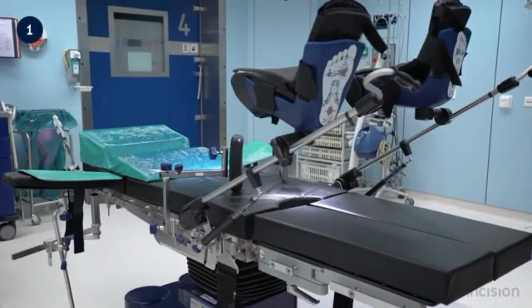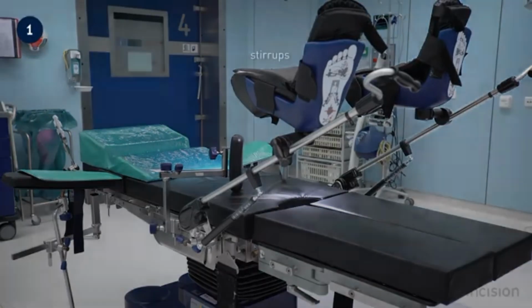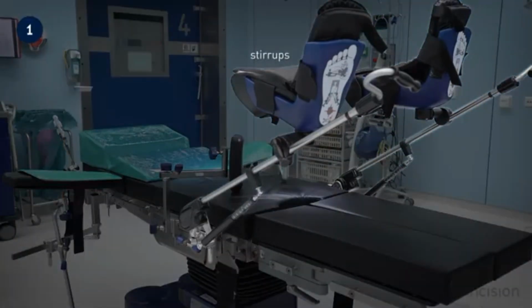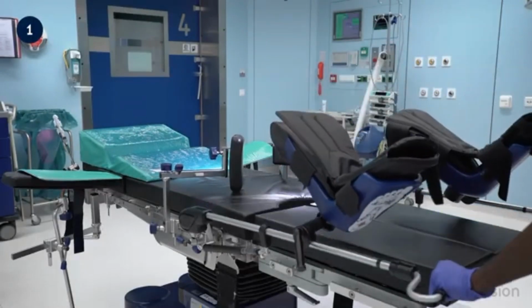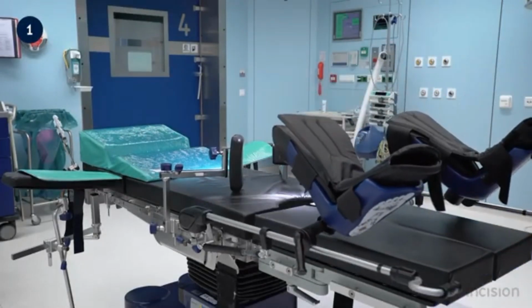The patient's legs can be positioned in a variety of ways. Stirrups are used when the patient is placed in the lithotomy position. This particular set of stirrups can be adjusted to allow different degrees of flexion of the hip. These are but a few examples of accessories that can be used to ensure safe positioning of the patient. For a more detailed elaboration of the surgical table and use of its accessories, refer to the course Surgical Table. Their use as well as the use of other accessories will now be discussed.